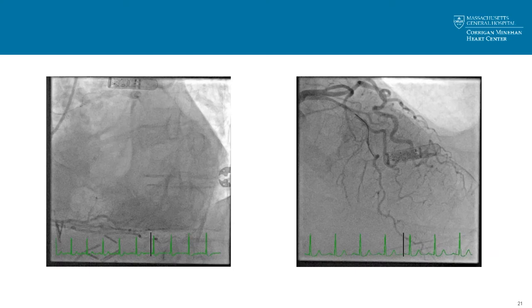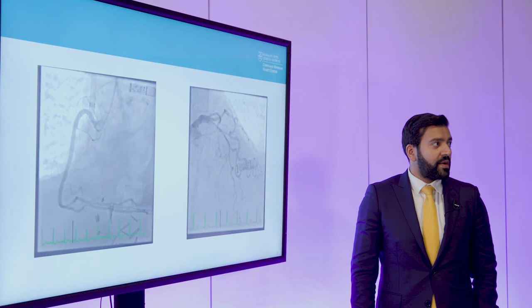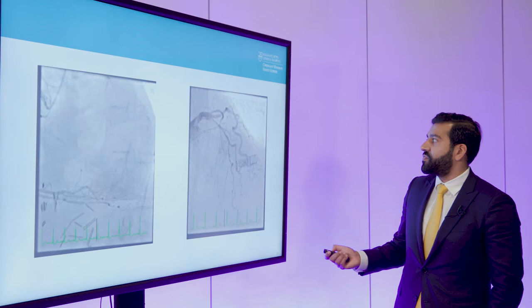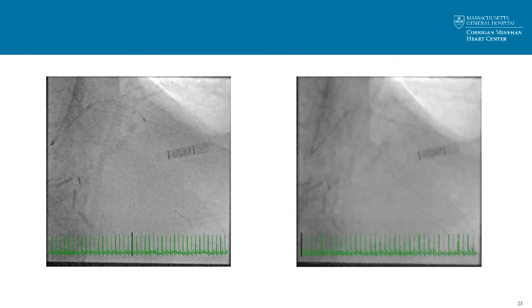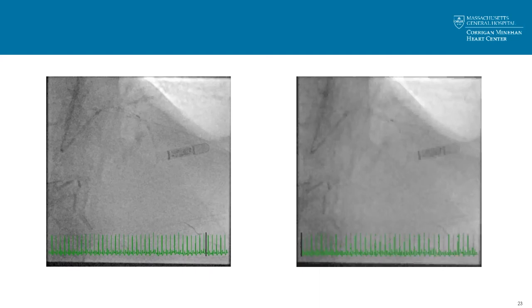Same thing — we wired the LAD. It's important to remember this curve: the vessel goes straight down, then there's a curve, then you're wiring again. If I asked you the caliber of this vessel, you'd say 2.5 — right? It's a proximal LAD in a male, so at least 2.5, potentially more. Same technique: a 1.5 mm balloon to create space, microcatheter goes down, gets swapped out for a rotofloppy, and then we do atherectomy from proximal to distal.